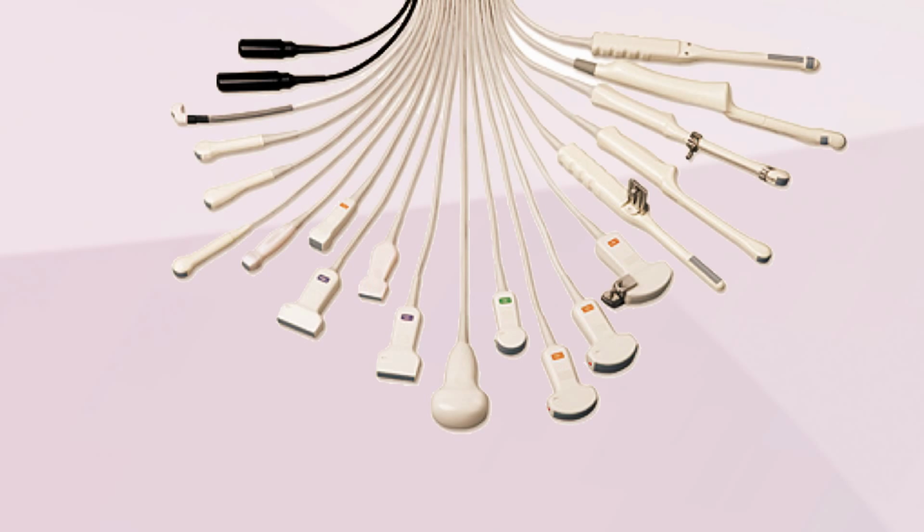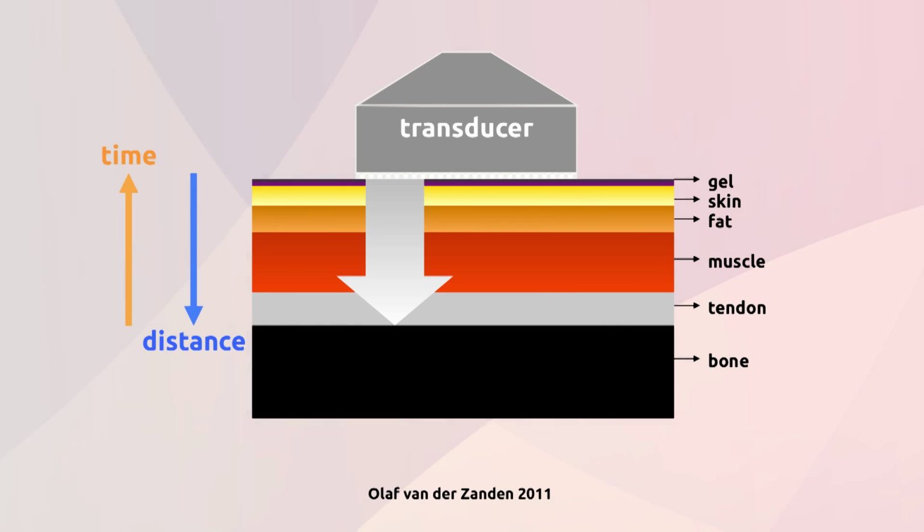First of all, we need a transducer. Transducers come in various shapes and dimensions and are designed for the body parts they have to assess. For MSU, we generally use the straight linear transducers. The transducer is an essential element of the ultrasound equipment, responsible for the generation of an ultrasound beam which is sent into the body and going through various soft tissue layers, like skin, fat, muscle, and tendon.